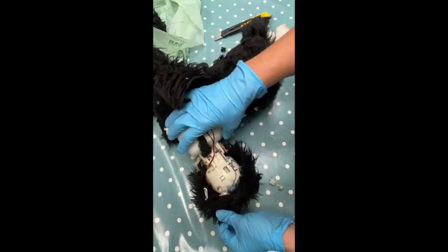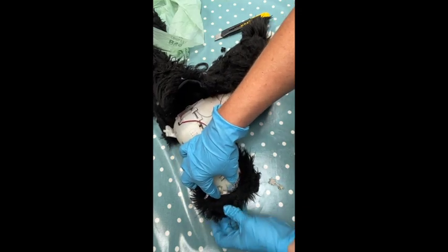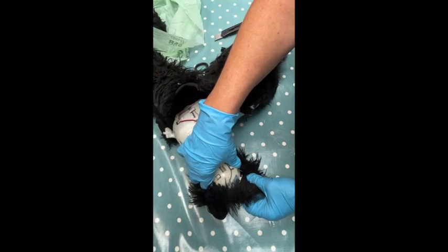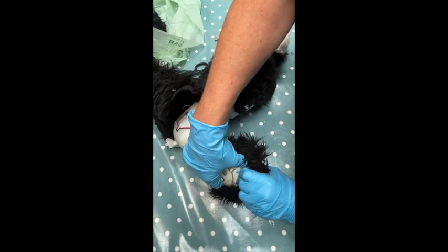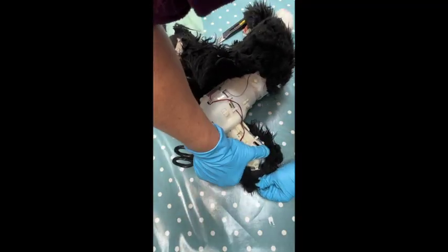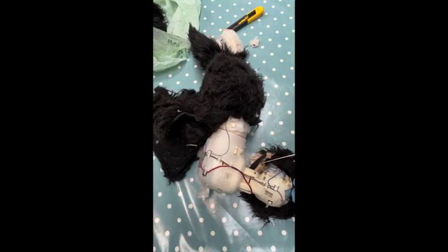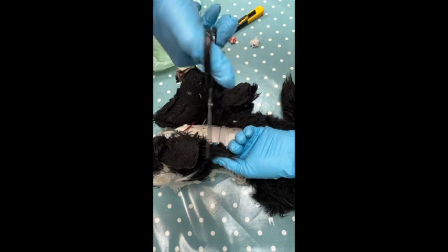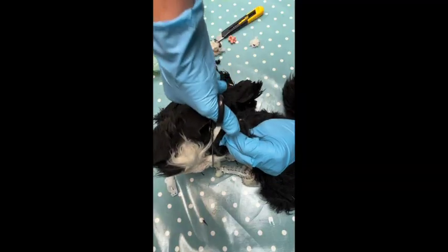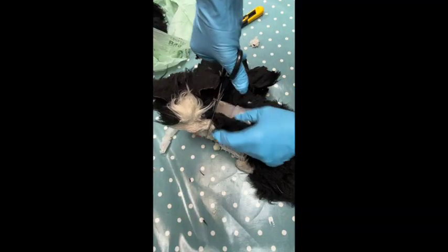I was thinking I'd see a nice big chunk of food and I'm just not seeing one yet. So the ears, they move as well. Little movement things there. Seems like decent. There it is. Yeah, there is definitely a sensor there. I always thought there was a sensor there. About to lose your whiskers, cat.